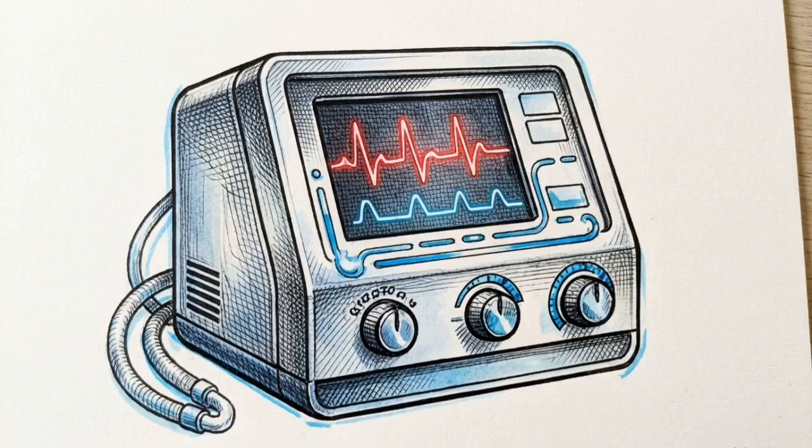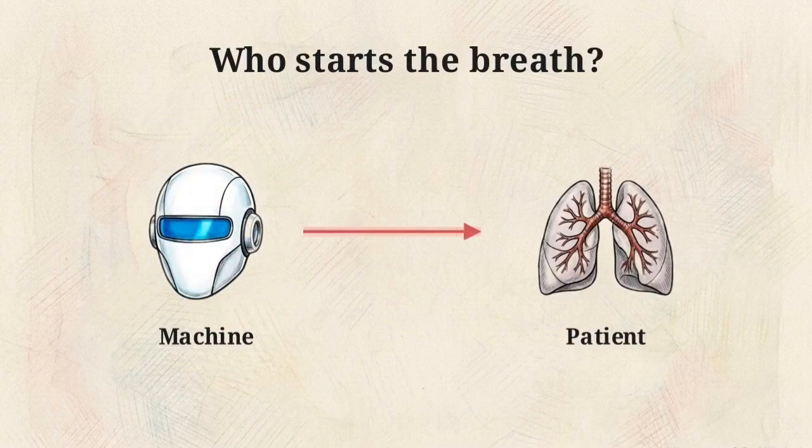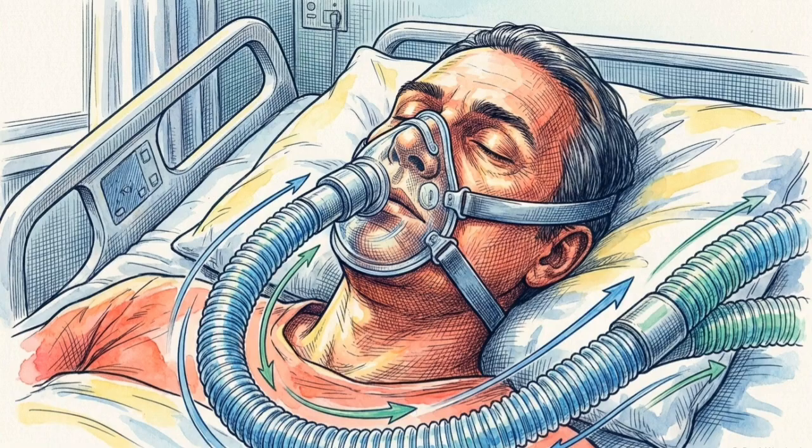We begin with control ventilator, or mechanical ventilator mode, often abbreviated as CV or MV. Applying the first half of our algorithm, the machine starts the breath. The patient has zero respiratory effort, typically because they are under general anesthesia or heavily sedated. The ventilator has full control.